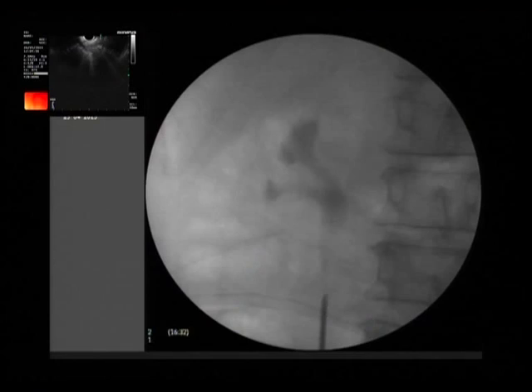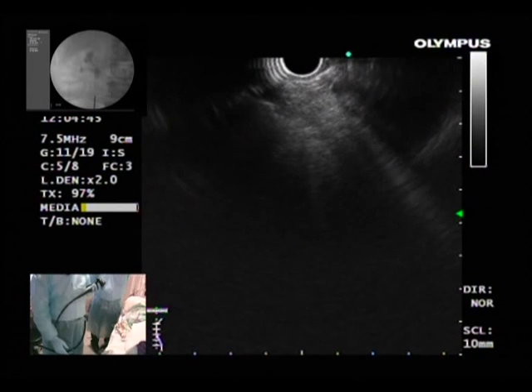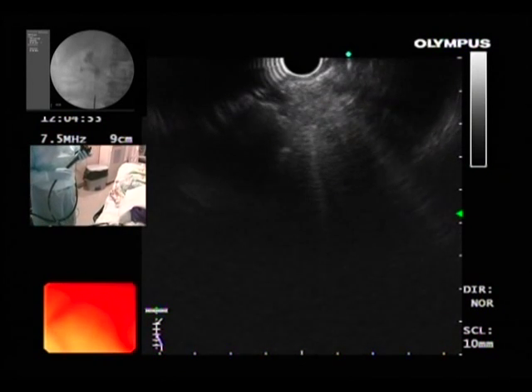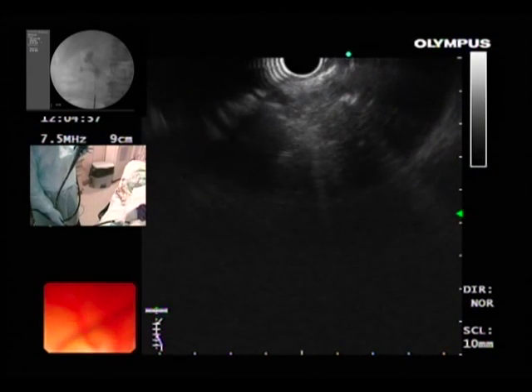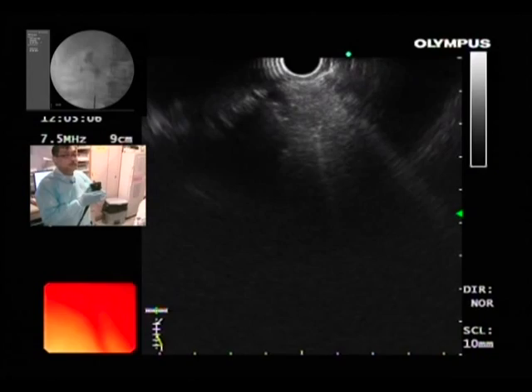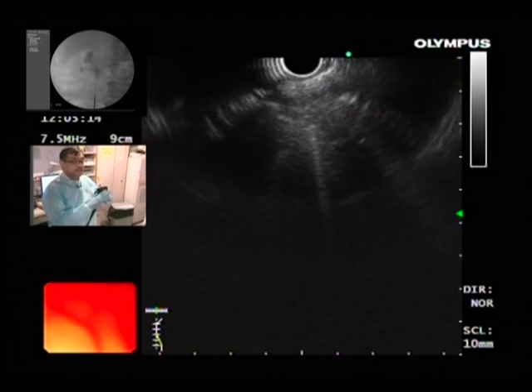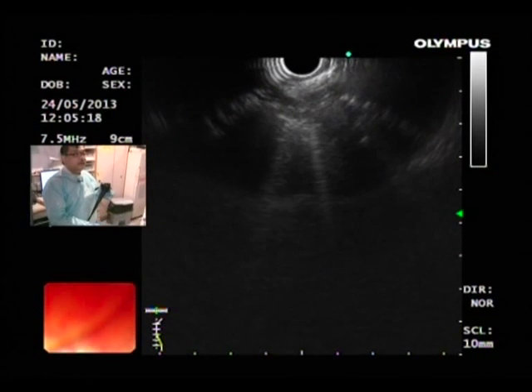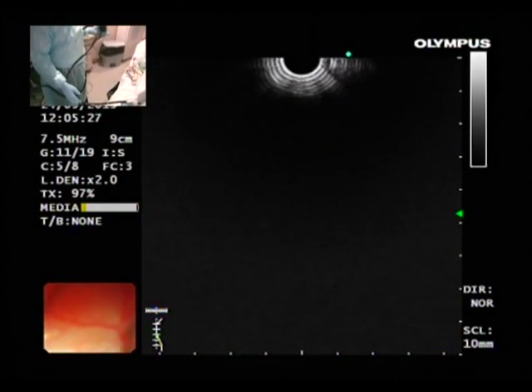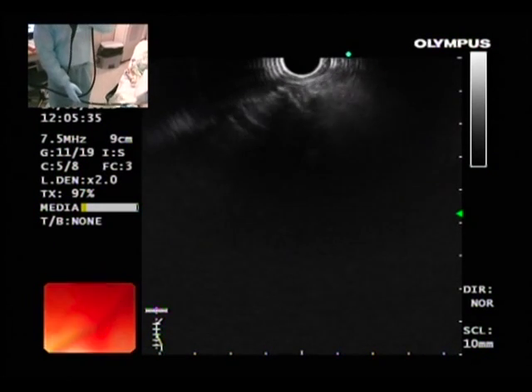My job is to do a celiac plexus neurolysis and try to look at the ganglia. But first, just basic information for those who are new to EUS: with a linear EUS scope kept straight, the transducer faces the direction of your controls. If the controls are like this, the transducer is anterior. To make it posterior, turn clockwise. To make it more anterior, turn anti-clockwise. So to see anterior structures, go anti-clockwise; for posterior structures, go clockwise.